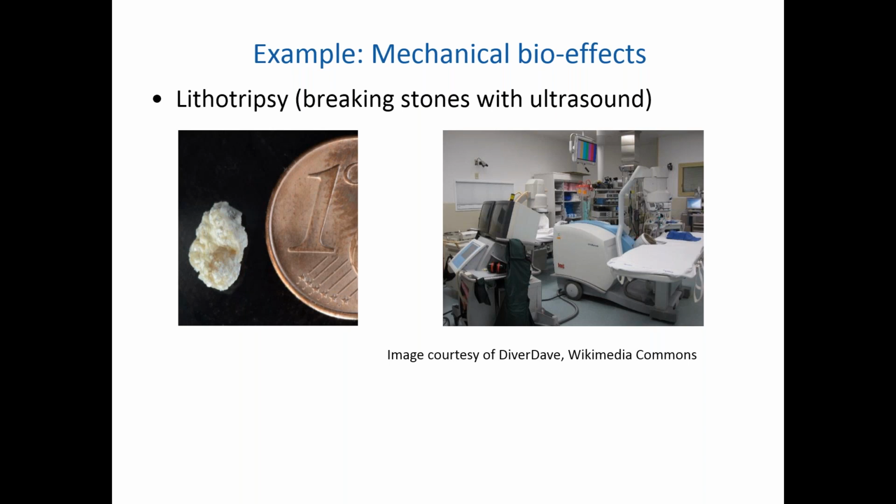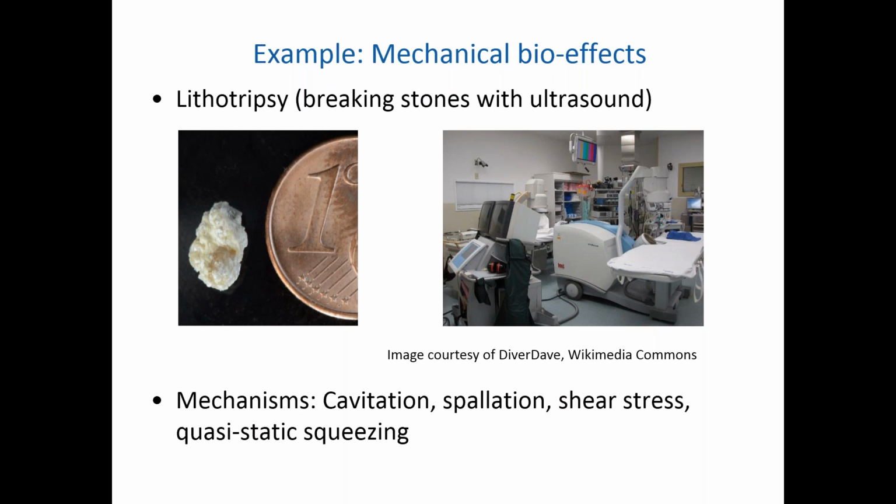Now, in this particular methodology within lithotripsy, we find that as those highly concentrated shock waves are focused down upon the stone that we're looking to treat, a number of effects could happen. I'll go through what those effects are. We can start off with cavitation.